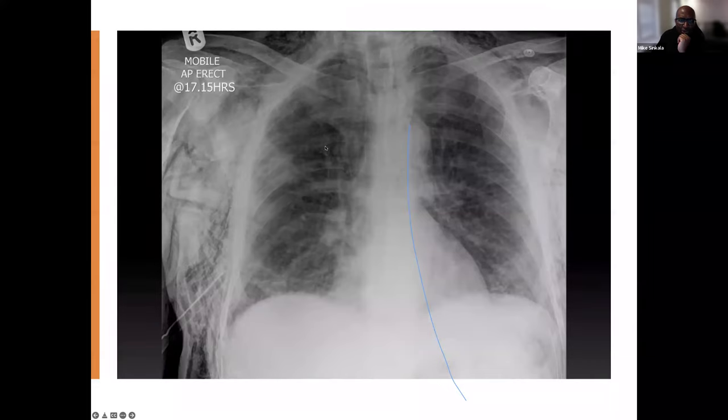Notice also that we do have the contours of the pectoralis major. I think there is air getting right into the fascia of the pectoralis major muscles, as it were. So these are the streaks that you are seeing here. But look at the diffuse subcutaneous emphysema here.